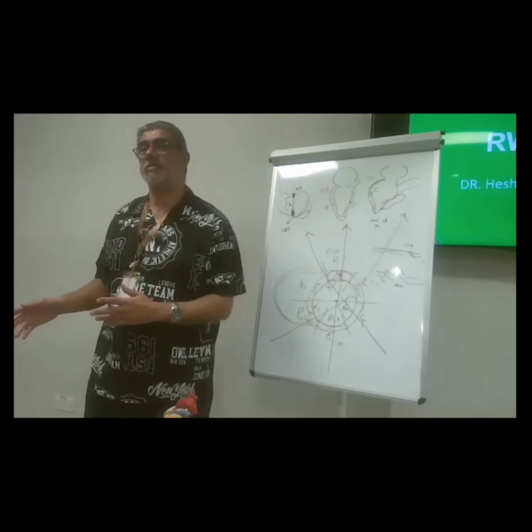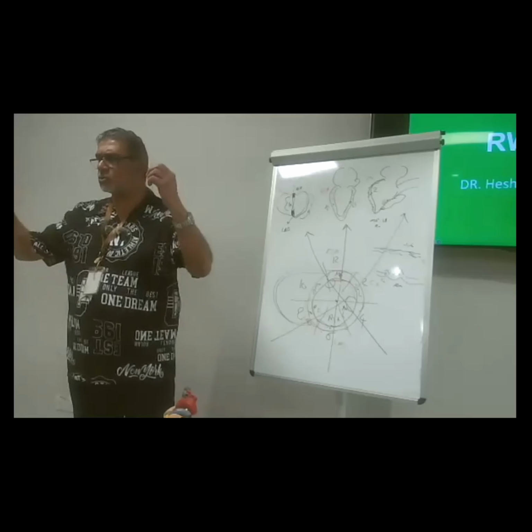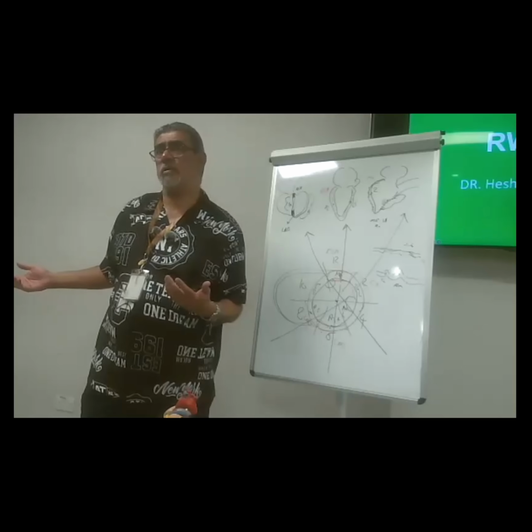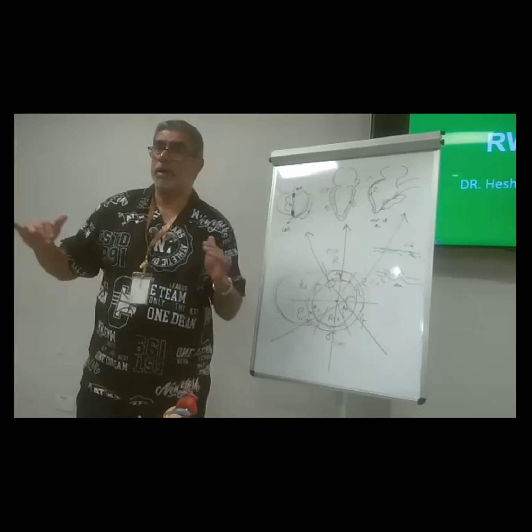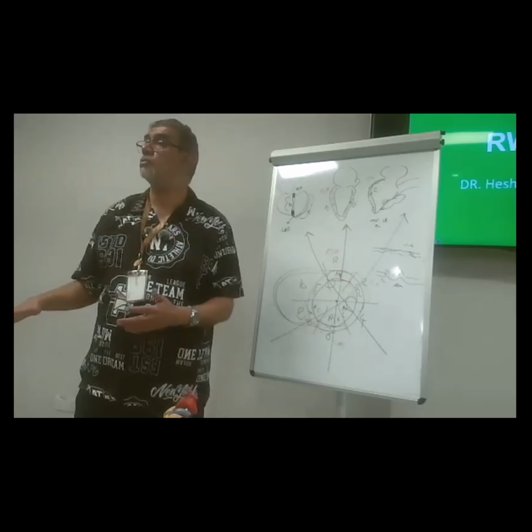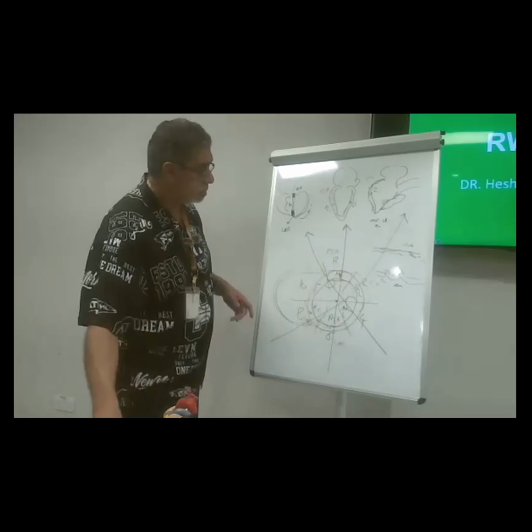Mitral replacement, aortic replacement. After finishing the surgery and coming off bypass, the hemodynamics are borderline again, not responding to filling, not responding to inotropes. You check here.